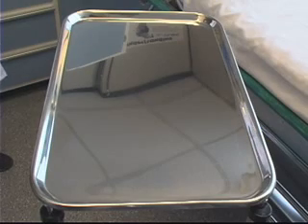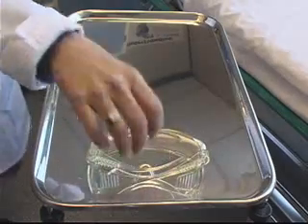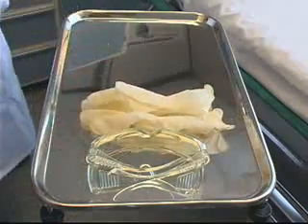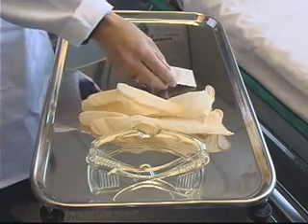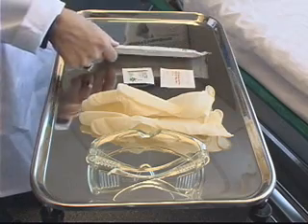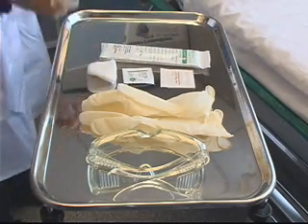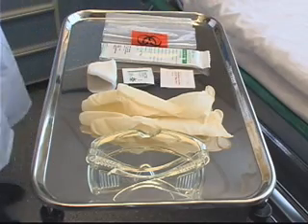The equipment necessary for arterial blood gas sampling is protective eyewear and gloves for universal precautions, a Povidone-iodine swab followed by an alcohol swab, an arterial blood gas sampling kit, 2x2 gauze, and a bag of ice to put the sample on to send to the lab.